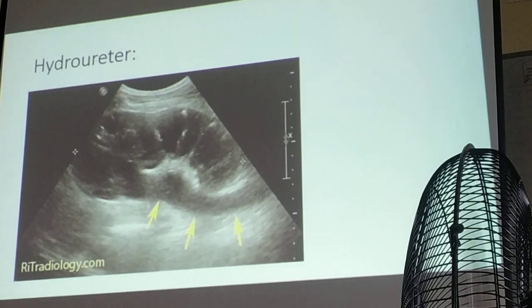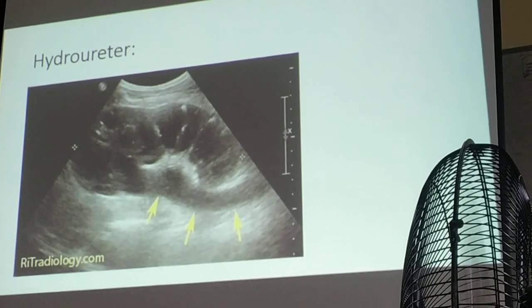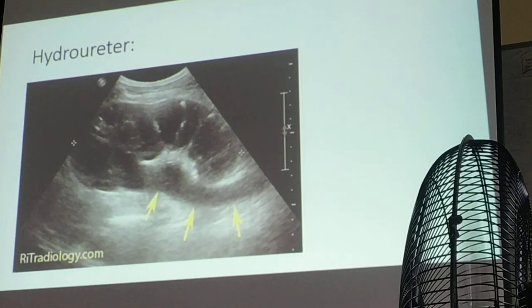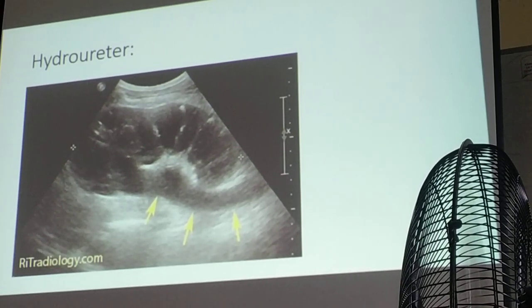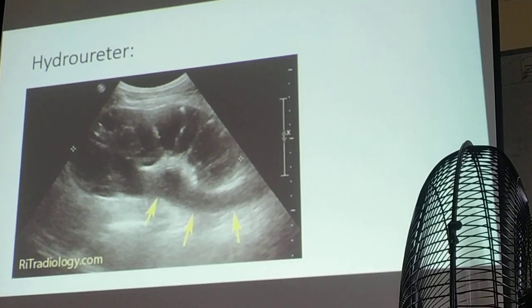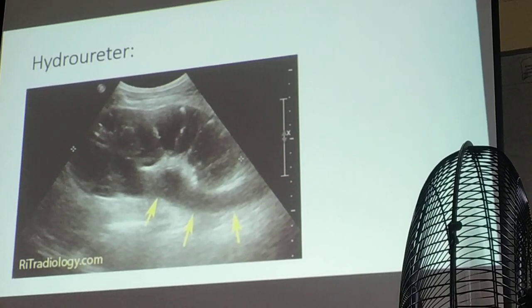Okay? This time, it's the ureter that is visible. As I've told you, never will you appreciate your ureters unless they are obstructed. Once the ureters are obstructed, definitely urine would not pass out, so your ureters would be filled with urine, so it would appear dilated.